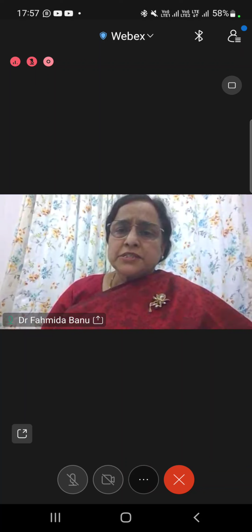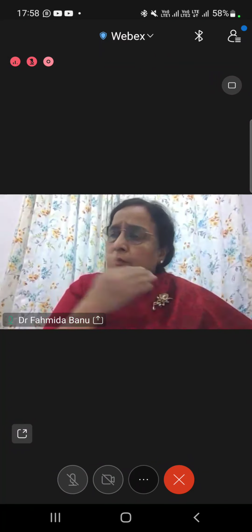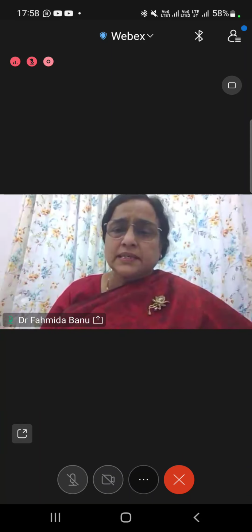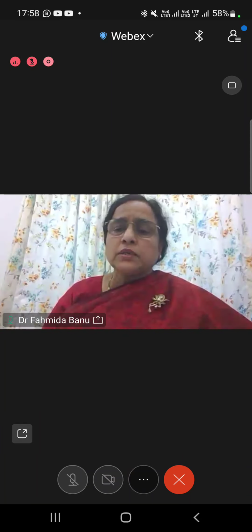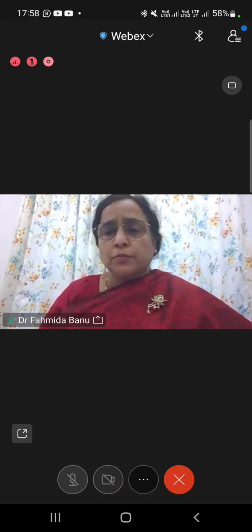It is not the position of the patient, because you have no other option except putting the patient in the lithotomy position. If you are asking whether it should be head low or not, these are secondary. They are not going to make any difference in fluid absorption or fluid overload problems.